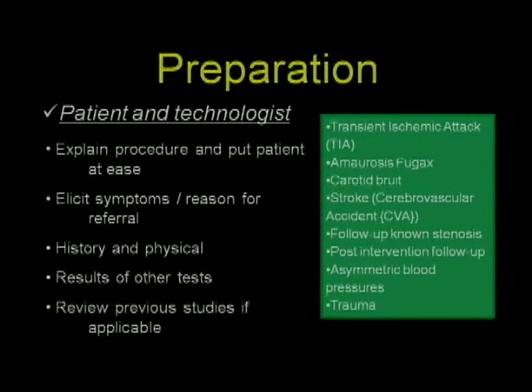These are some of the common indications for carotid artery testing: transient ischemic attack, a TIA, amaurosis fugax, carotid bruit, history of stroke, follow-up of known stenosis, the post-intervention follow-up. Any patient with asymmetric blood pressures probably is indicated, and any trauma to the area of the neck.